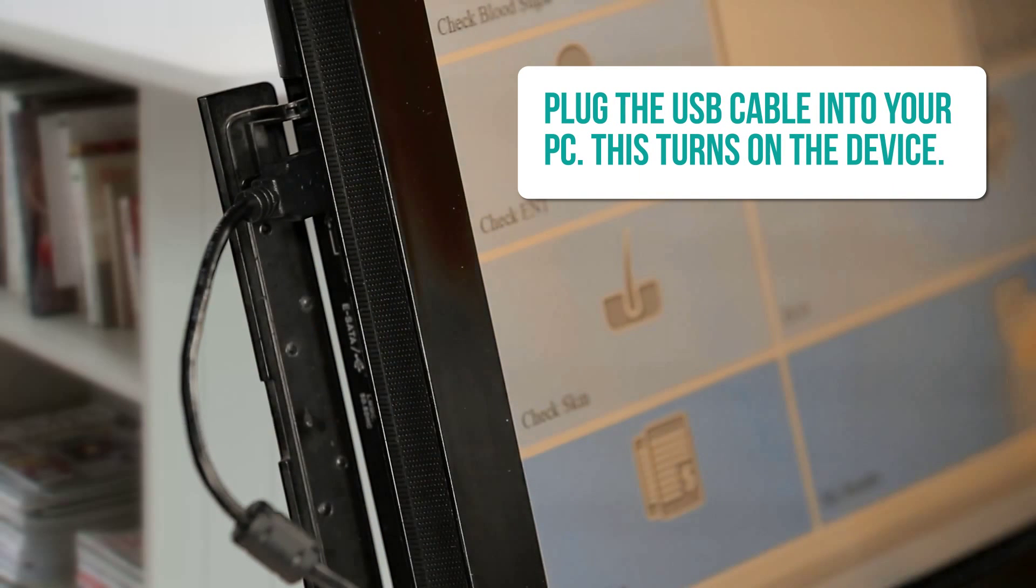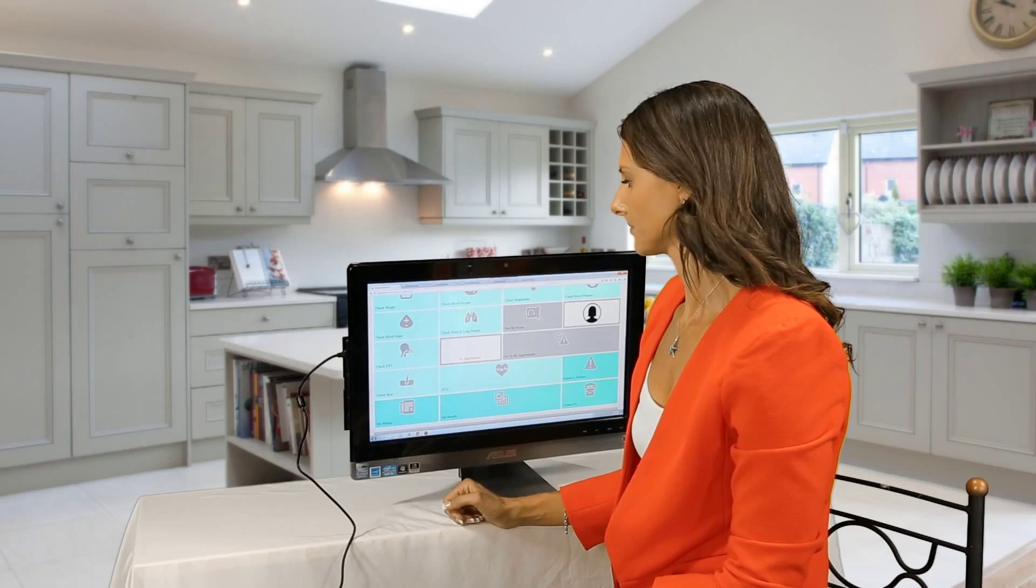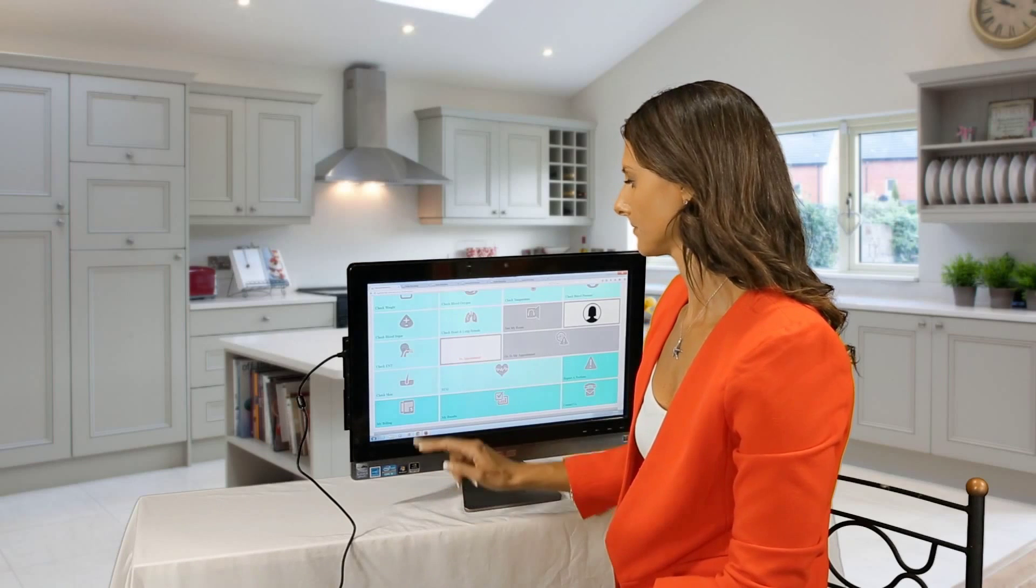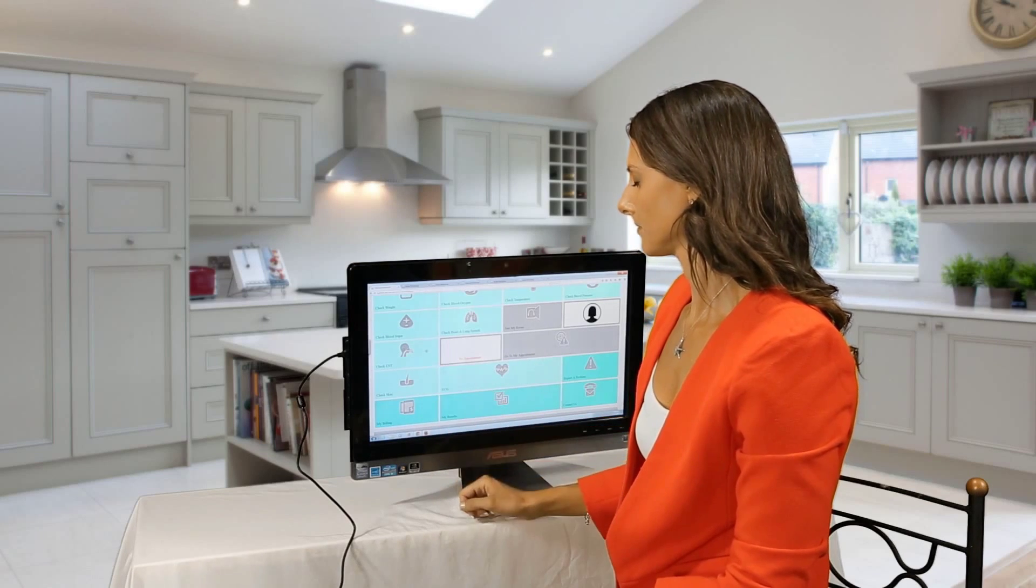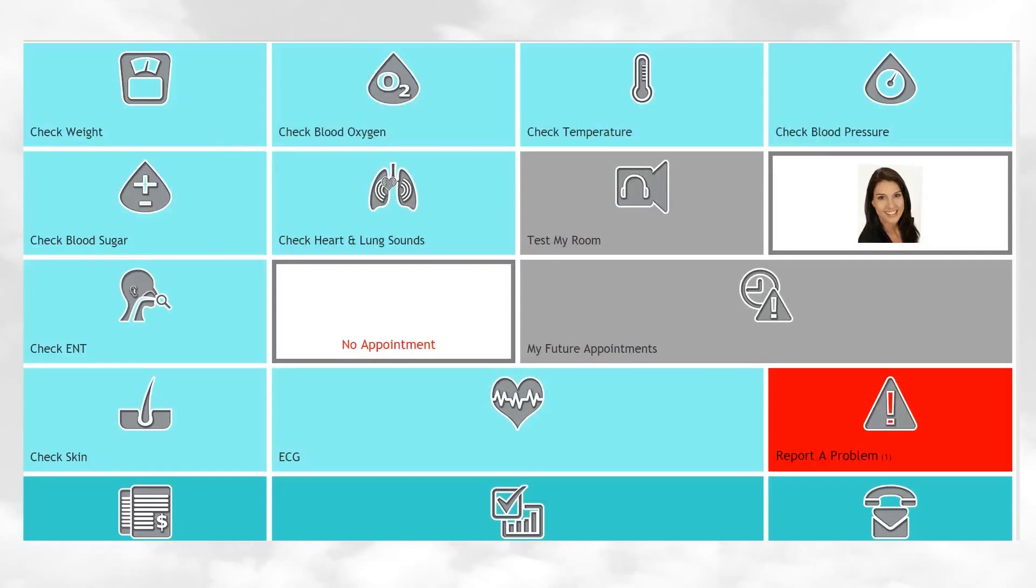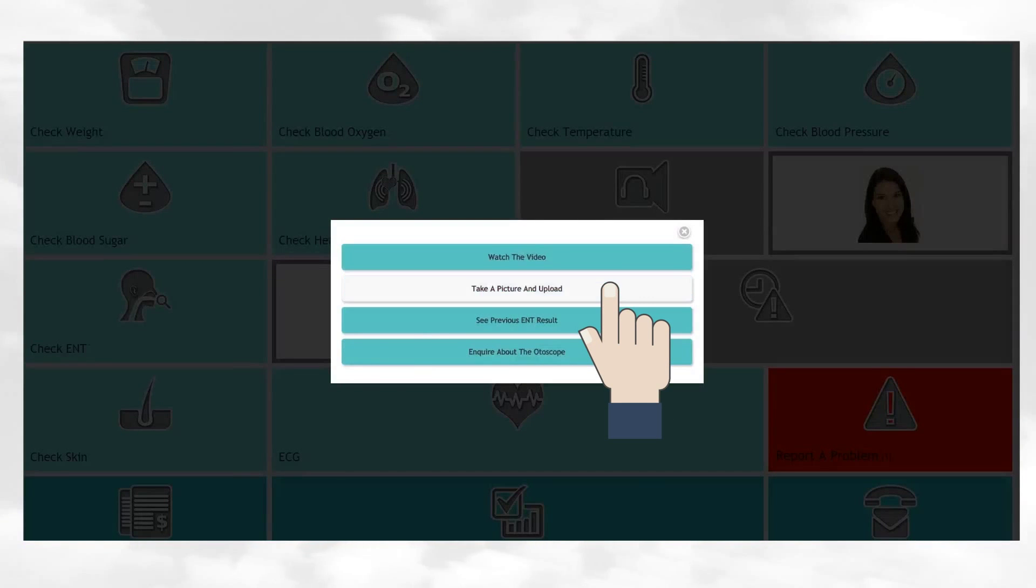Simply plug the USB cable into your PC and this turns on the device. Go to the My Online Clinic website, click on Check ENT and click on Take a Picture and Upload.